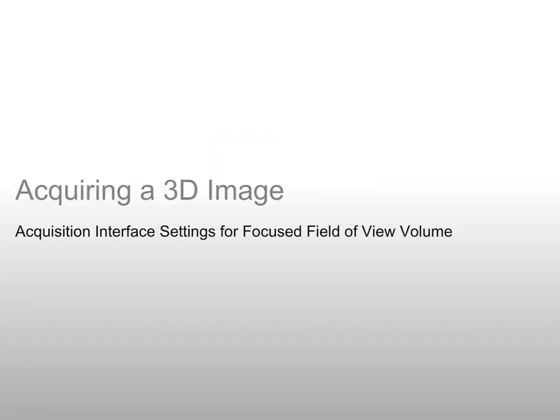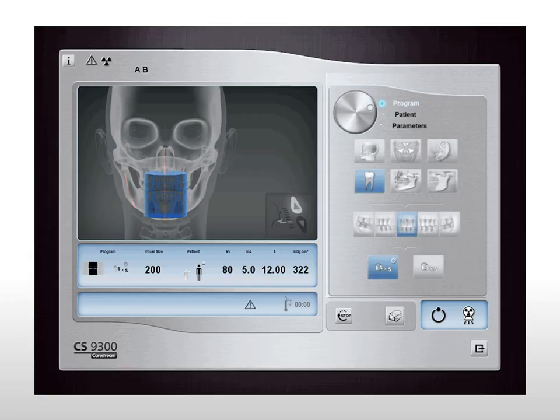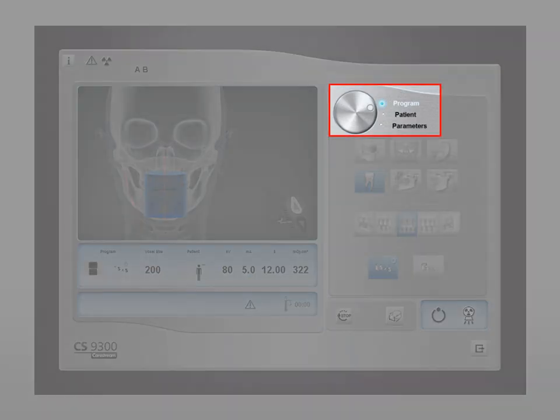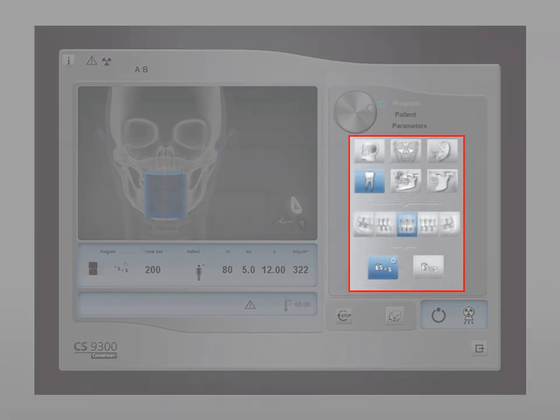Acquiring a 3D image: acquisition interface settings for a focused field of view volume. Use the program button to select examination options. In the 3D acquisition window, select the program button to access the program pane, then select the desired radiological exam.